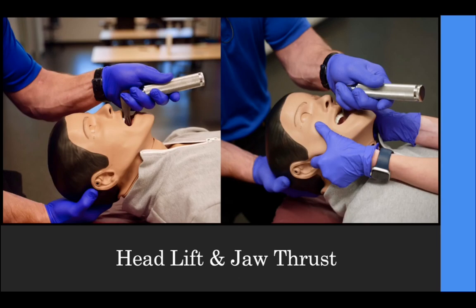So the head lift essentially means as I'm walking down the airway performing laryngoscopy, in addition to my towel roll, I can slide my hand or my partner's hand under the head and lift up as I go to improve my view. The other thing you can do to improve your view is have the partner reach up from below the patient and perform a nice strong jaw thrust.